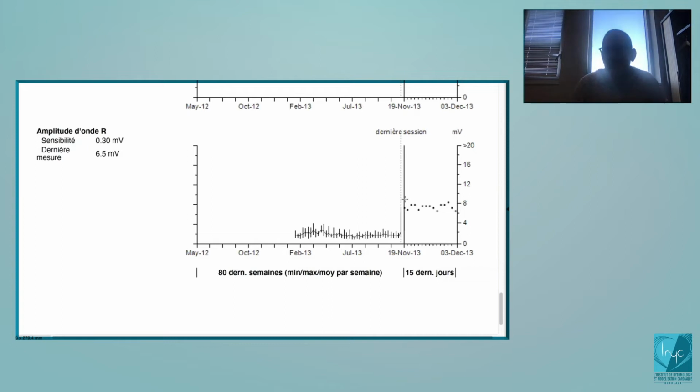Okay, so it is not systematic. It's not like with pseudo-bipolar sensing, the amplitude is increased compared to bipolar. We have studied more than 100 patients, and at the end, the average value was the same with bipolar and with pseudo-bipolar sensing. But patient by patient, sometimes there were huge differences in one configuration and in the other one. So if you encounter a situation with a low amplitude sensing with bipolar, you may try pseudo-bipolar programming in Medtronic devices, and you may solve the situation.